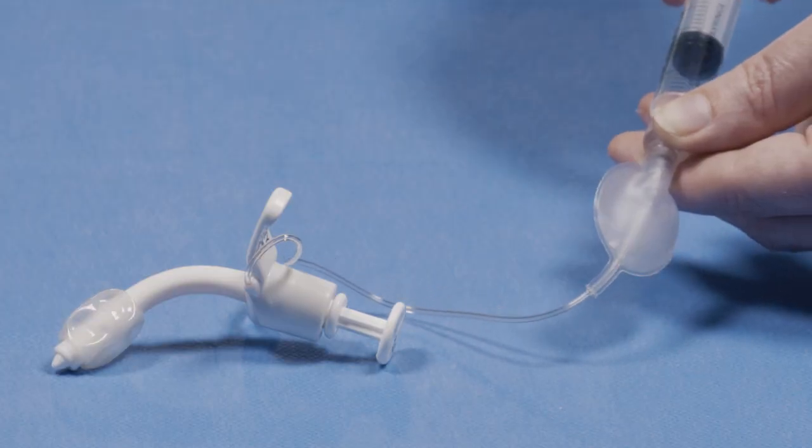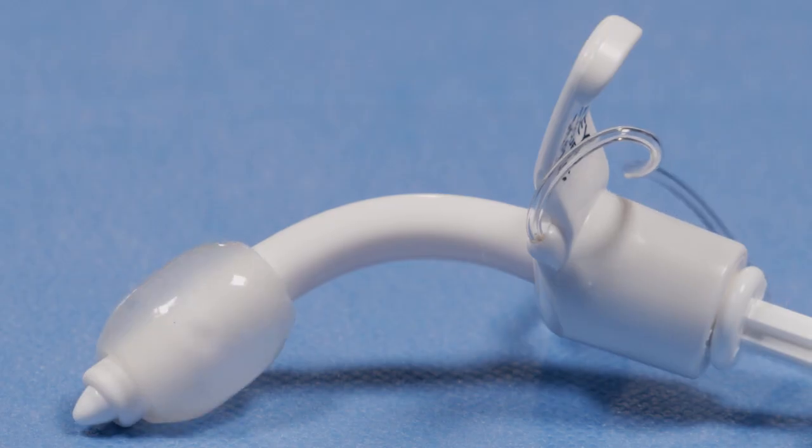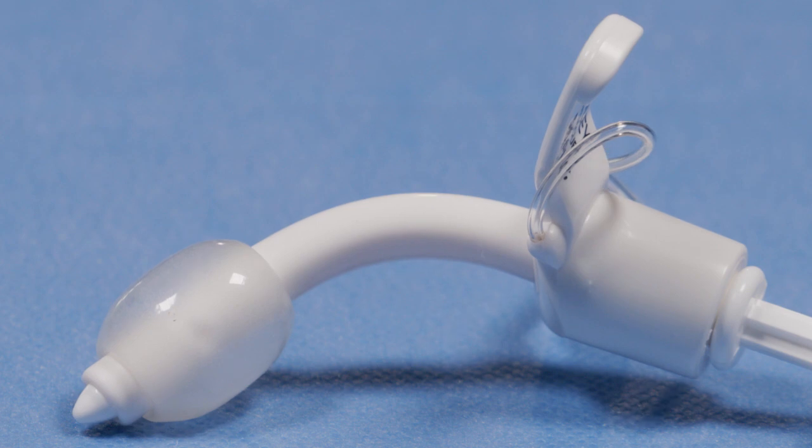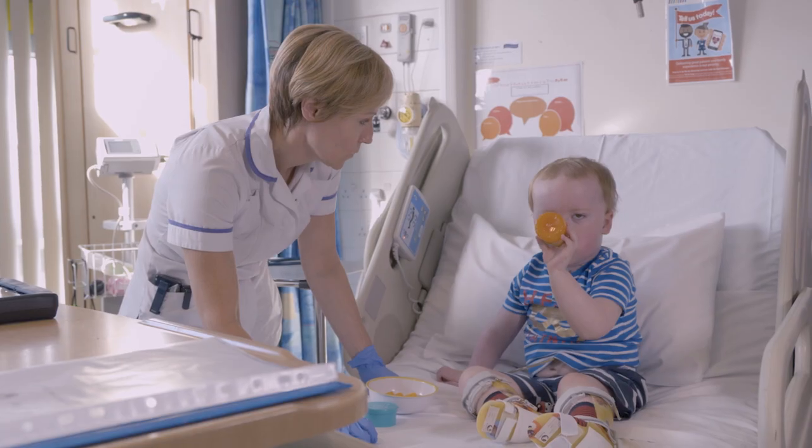Every variety of a child's tube you can also get with a cuff. We don't tend to use them very often in children. The main instances would be if the child was unwell and struggling with their ventilation, so they would need a cuff that provides a seal to allow us to ventilate them effectively.